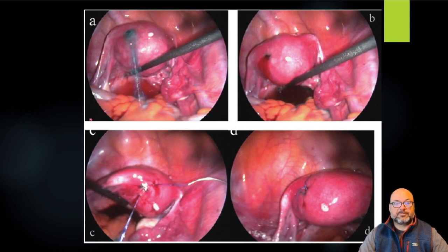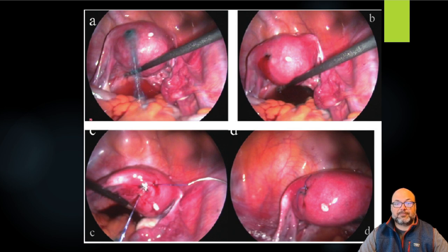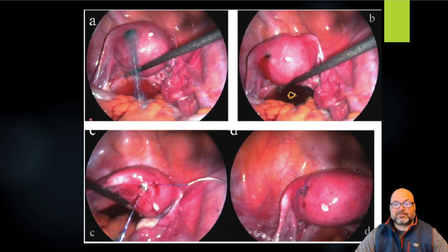Similar here — this was at the time of chromopertubation, and the uterine manipulator catheter they used perforated the uterus. This is actually some methylene blue stained fluid that is coming out of the uterus — you can see that dark fluid collecting in the posterior cul-de-sac. So there's the defect there, and doing some laparoscopic suturing for hemostasis.